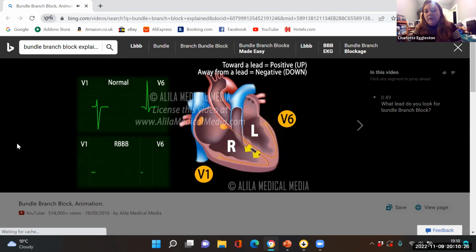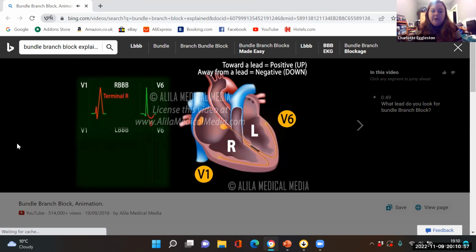So this time our Q wave is normal because we're still going from right to left. So we start off with a kind of normal depolarization of the left, which is normally the bulk, but then we've all got to go to the right, so effectively then go to the opposite side of normal. Hence, you get this little... That's where we get our marrow, because it looks a bit like an M and a W.